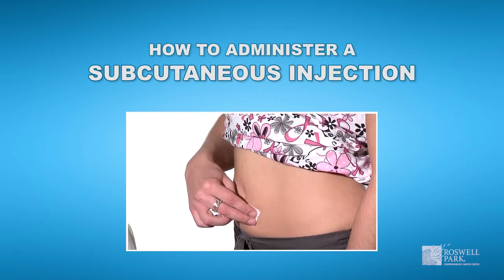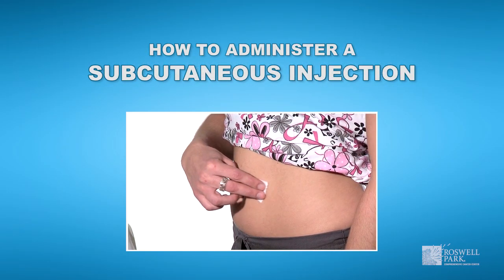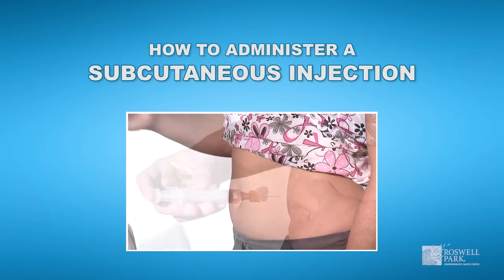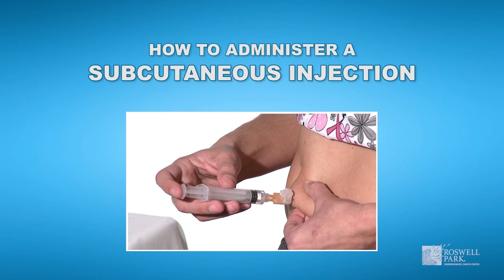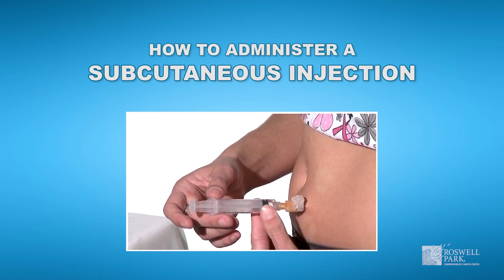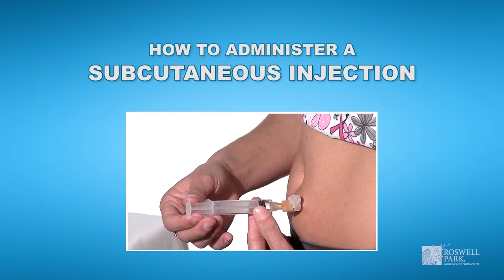This video is going to demonstrate how to give a subcutaneous injection. A subcutaneous injection delivers medication into the fatty tissue just below your skin.